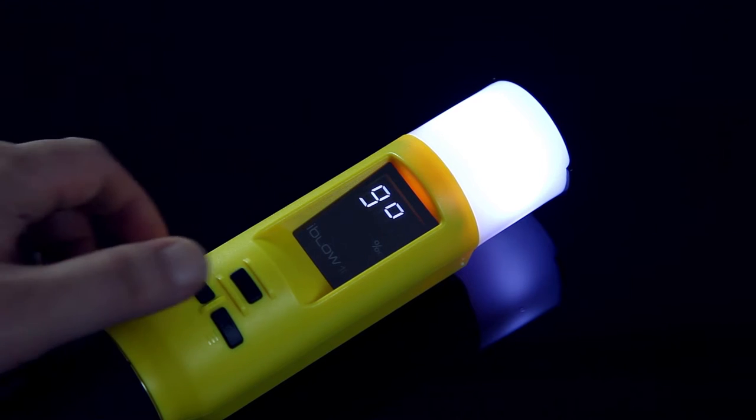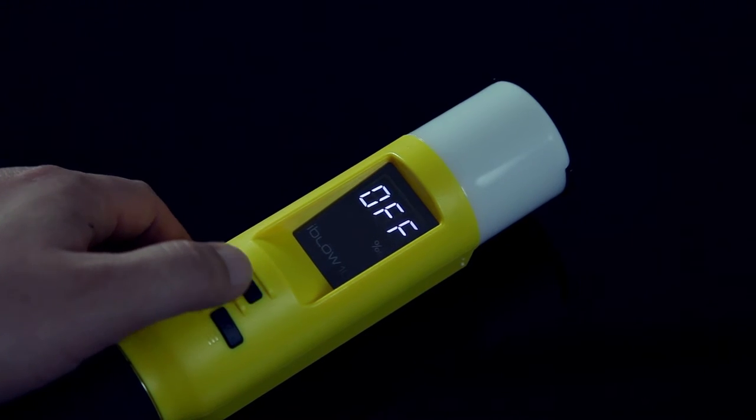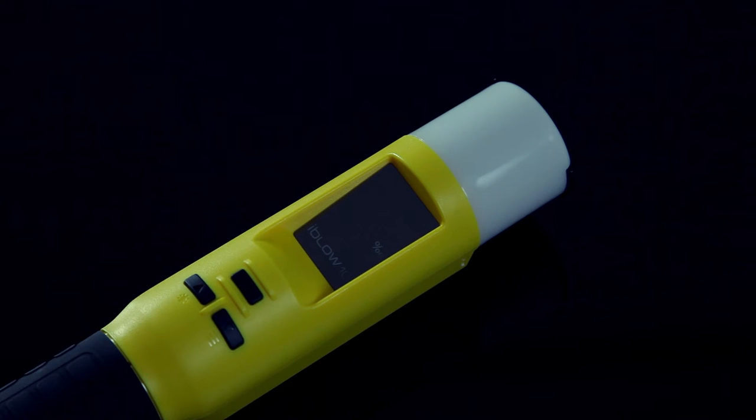When the power button is pressed down for three seconds, the window will display OUT. Press it once more, it will display OFF and turn the power off.